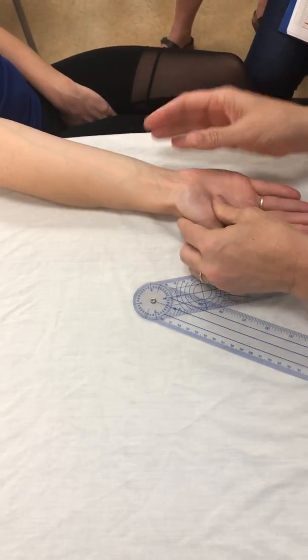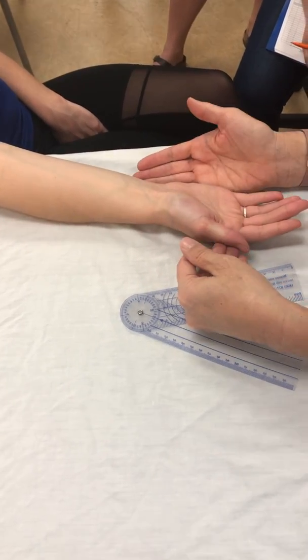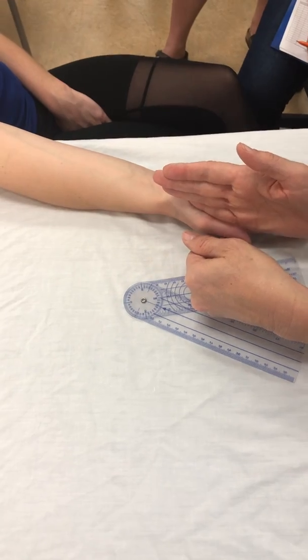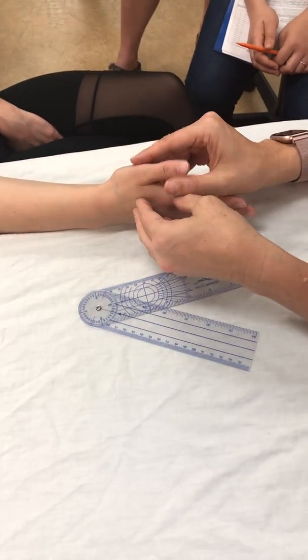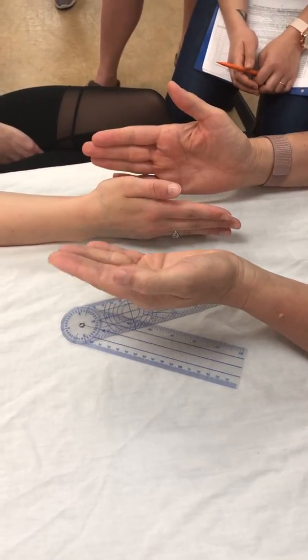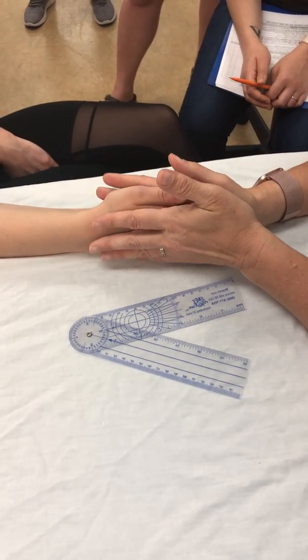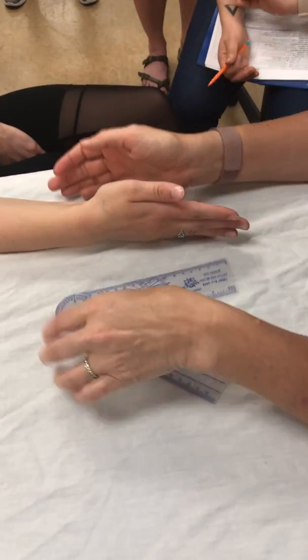The only time we change our 0 is here, because this is the anatomical position, and so we need to document what 0 is in the anatomical position. If you're here and you're stuck here, you're no longer in the anatomical position, so we don't call that 0. We take that as a lack of motion, in that case a deficit in abduction. Okay, is that clear to everybody? Yes. Okay, thank you.